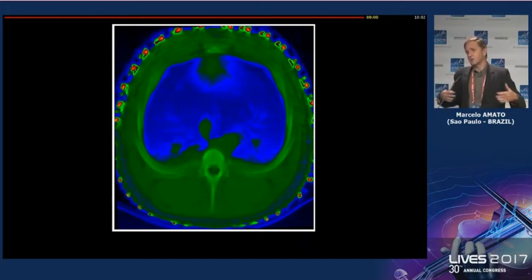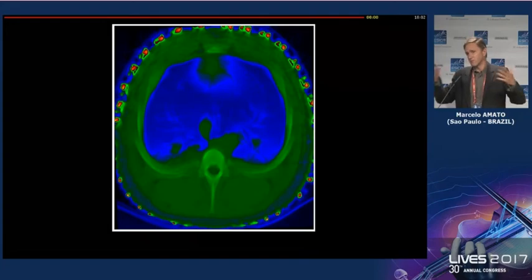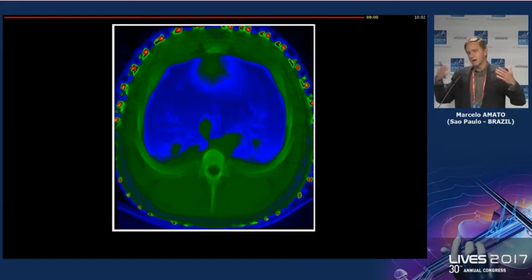And we are collecting data to check the safety of this procedure. We never had a side effect in animals, but obviously in humans, we need more data. We cannot say that it's absolutely safe at this point. We have observed a slight increase in stroke volume during the injection of saline, but this is a well-described reflex. That's it. Thank you.